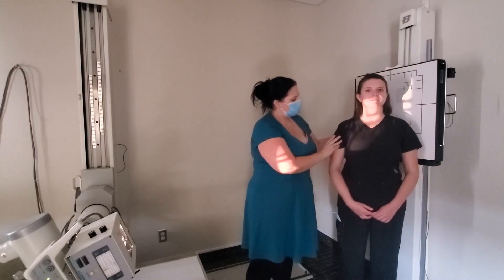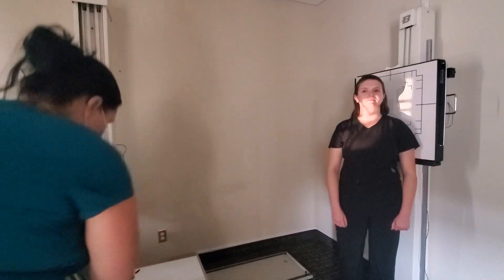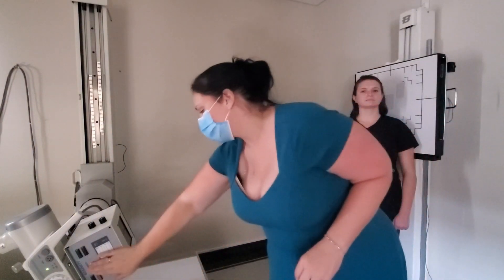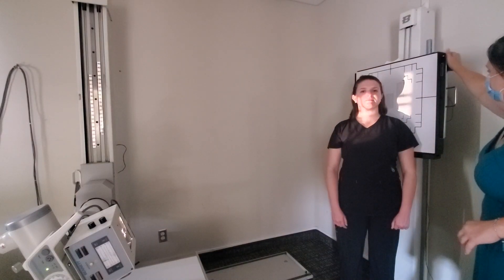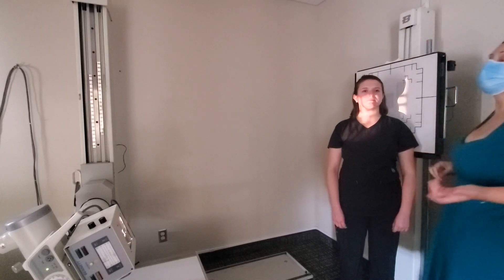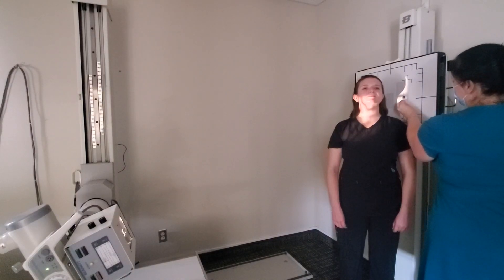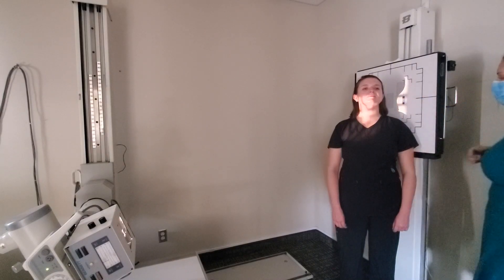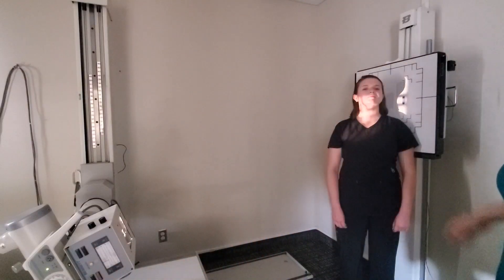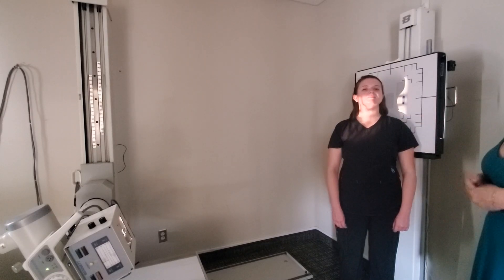Take one more baby step forward and come up just a little bit since C4 is our entrance point. Touch the tube, touch the bucky. Collimate down. You want the proper head position — just elevate slightly to get the mandible out of the vertebral bodies, but not so far back that the occipital is getting into the spinous process area. Put your marker on the side that's against the image receptor — for LPO that's your left marker.